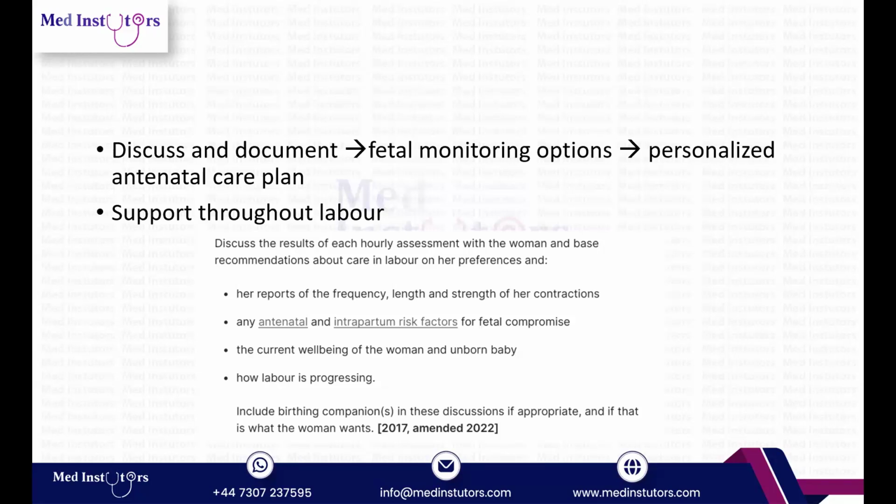So, what the guideline says is that for every mother, it is essential that we talk about the monitoring of the fetal heart rate in labor during her antenatal visits. And whatever her choice is, that needs to be documented in her personalized antenatal notes. So, this decision as to what is used, either intermittent auscultation or continuous cardiotocography, can be decided by taking into maternal considerations as well as fetal considerations.